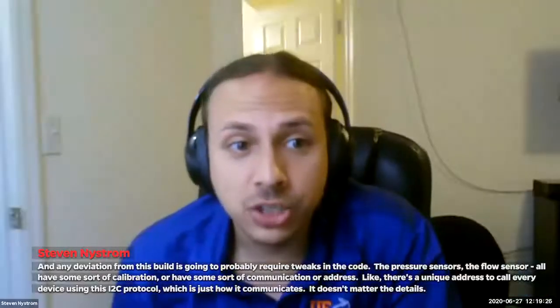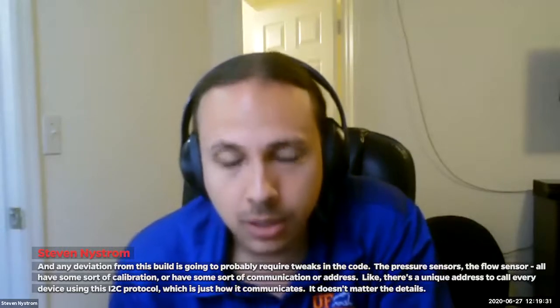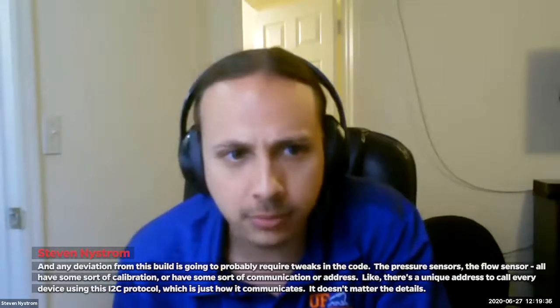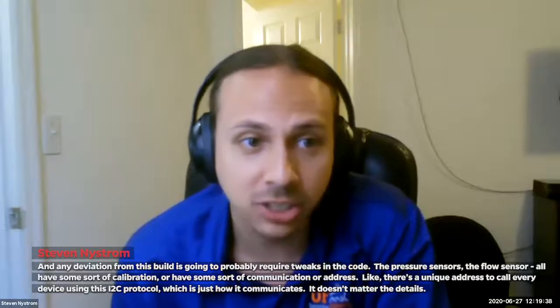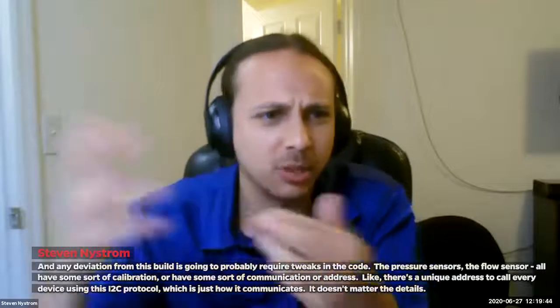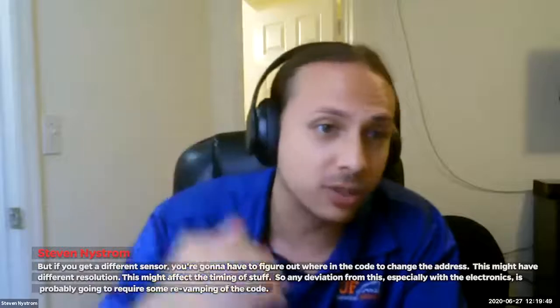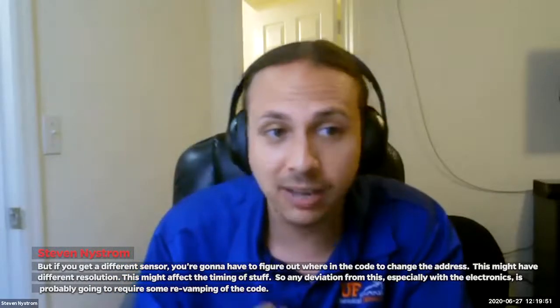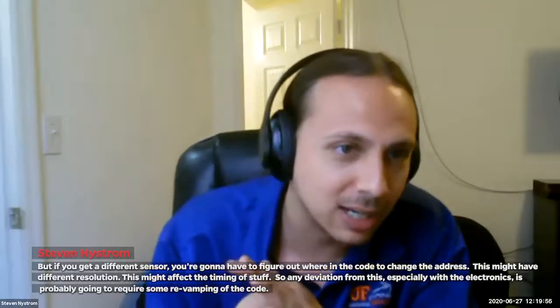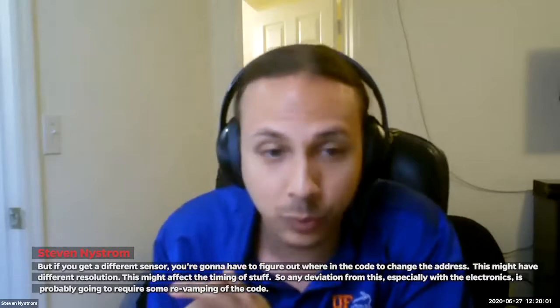And any deviation from this build is going to probably require tweaks in the code. The pressure sensors and the flow sensor all have some sort of calibration or communication address. There's a unique address to call every device using this I2C protocol, which is just how it communicates. It doesn't matter the details. But if you get a different sensor, you're going to have to figure out where in the code to change the address. This might have different resolution. This might affect the timing of stuff. So any deviation from this, especially with the electronics, is probably going to require some revamping of the code.